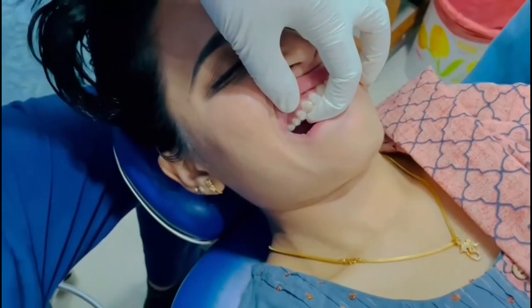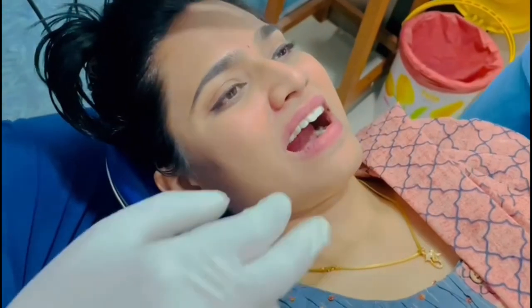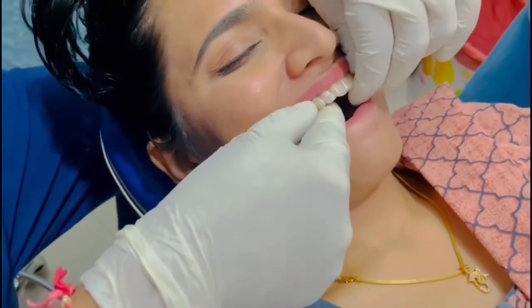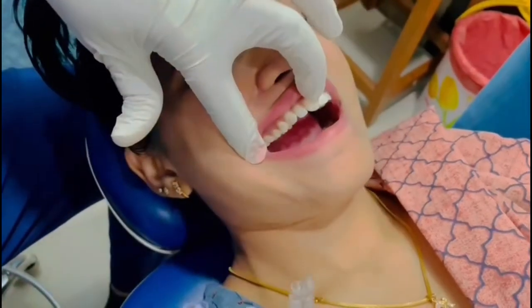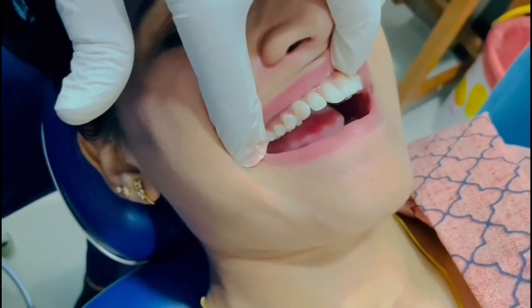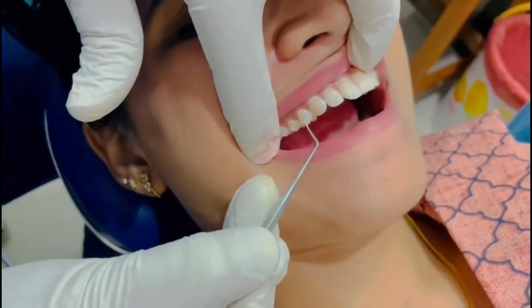Hold the tray and increase the curing time. Now we are removing the tray — you can see the attachments are transferred to the teeth.